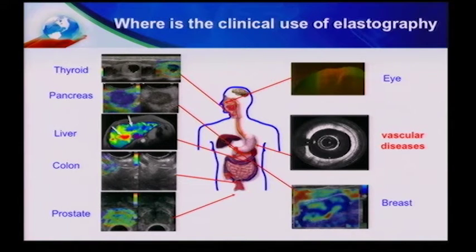But there are a lot of other applications where ultrasound and MR have not been very successful. For example, in ophthalmology disease such as cornea, and in cardiovascular disease such as atherosclerosis. In this case, we actually need much higher spatial resolution compared to what MR and ultrasound can provide. So today I will just focus on one application, cardiovascular disease, and if time permits, I will also talk about corneal disease.